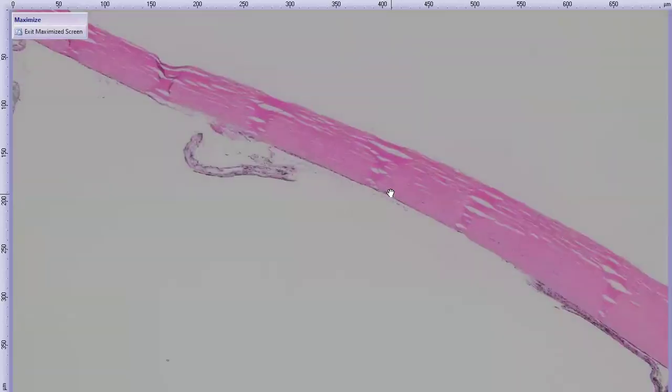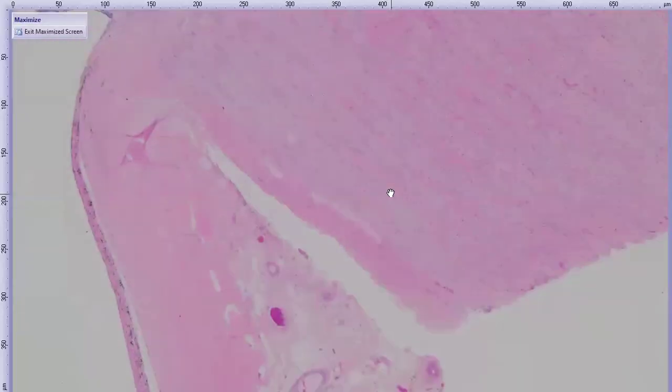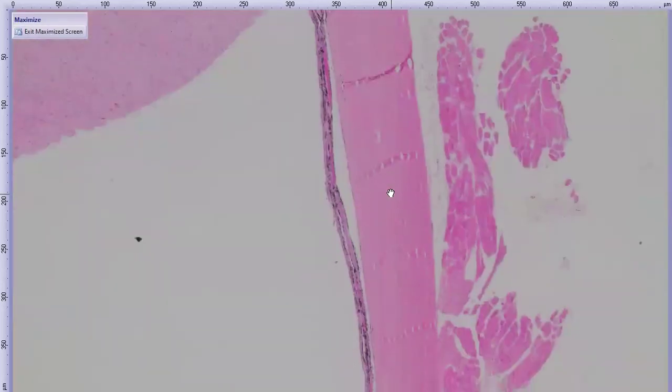Right? So in this case, we do have two things happening at the same time. We have the corneal disease, well, maybe three, right? Because go back to that optic nerve, it was markedly cupped and atrophied, so there was also glaucoma. There are other things happening here, but we're just going to leave it at that. So what's the potential sequence of events? There are many ways to skin this cat or this horse, but you can have the equine recurrent uveitis, the multiple inflammatory bouts leading to a secondary glaucoma.